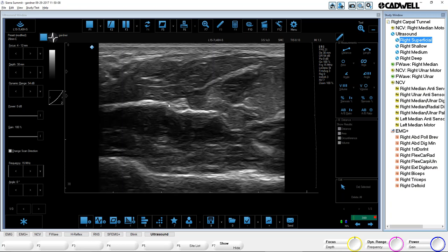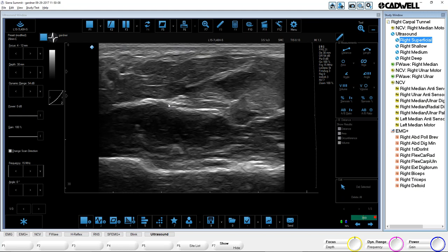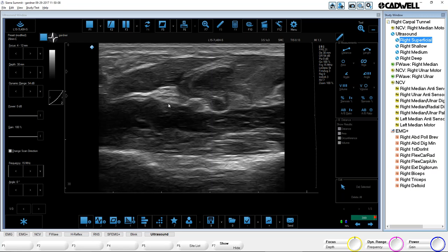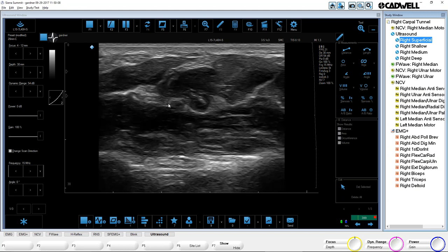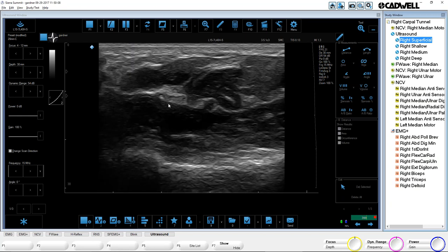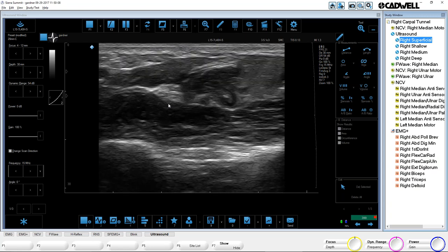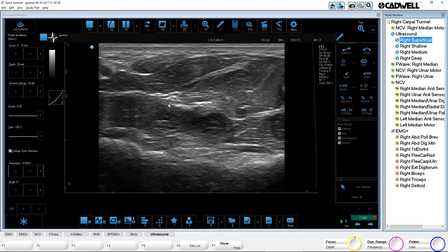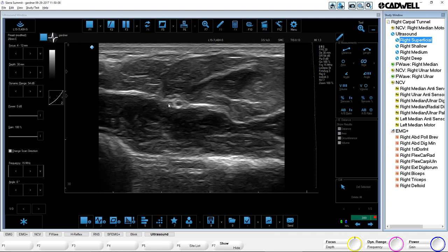There are three round structures you're typically looking at: vessels or arteries, nerves, and tendons. A nerve is going to keep its shape and color more so than tendons and vessels. If you see the median nerve there and off to the right is the tendon — as I tilt my probe, the tendon will almost completely disappear while the nerve stays visible. The nerve is a little more stable than the tendon. Knowing the anatomy is important, but you can tell the difference. The nerve also has a honeycomb shape and usually keeps that shape. Tilting the probe gives you a better or worse picture because you're trying to get a perfect cross-section.